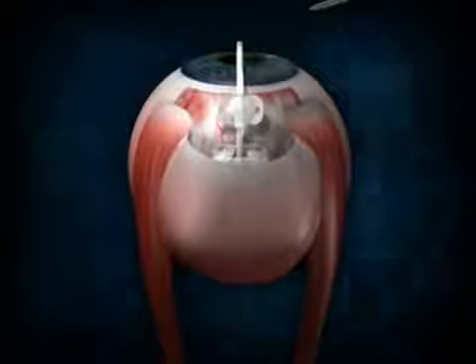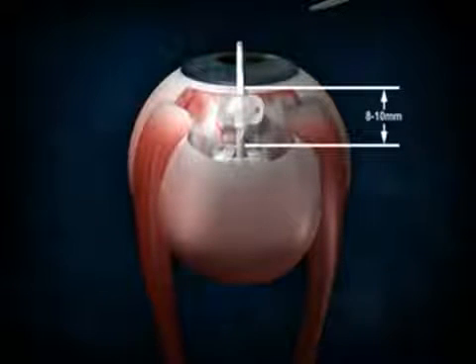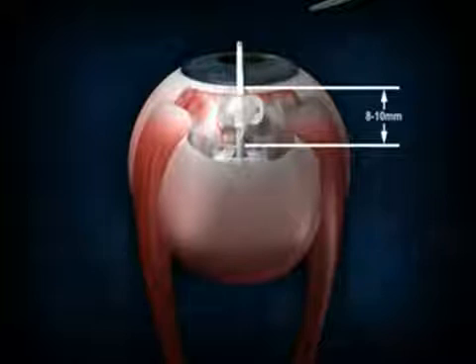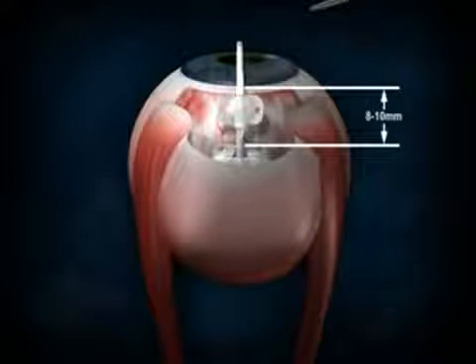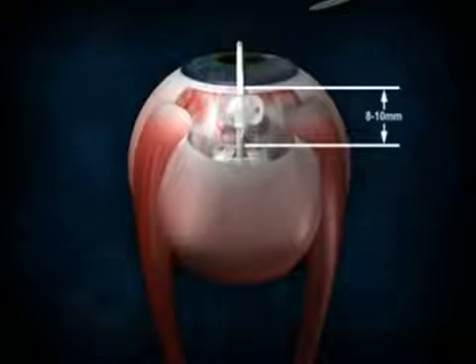Continue to push the valve in until it can distinctly be seen 8 to 10 millimeters away from the limbus. If available, use calipers to be certain that the valve is well placed between the rectus muscles and that the anterior edge is measured at 8 to 10 millimeters away from the limbus.